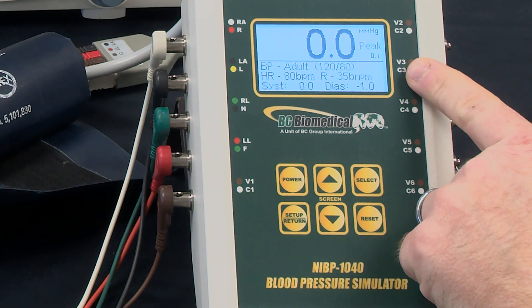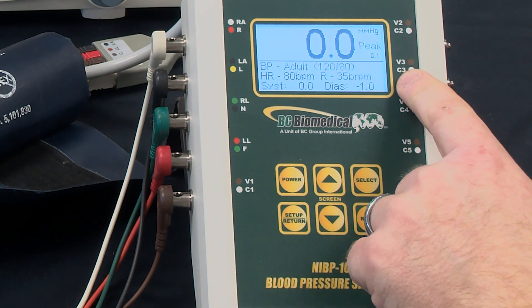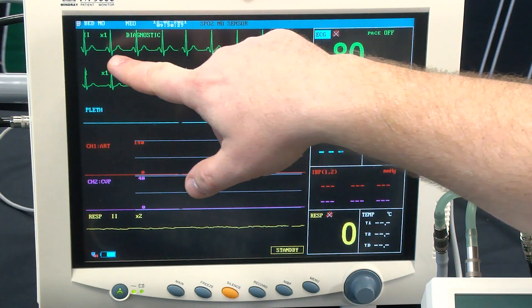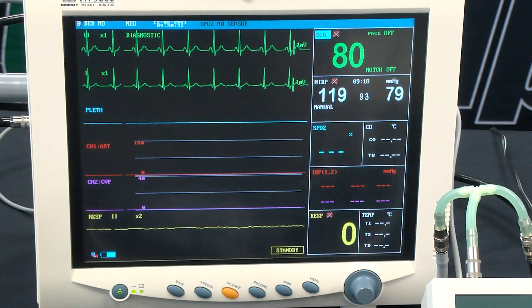The NIVP will default to 120 over 80 BP simulation with a heart rate of 80 beats per minute and a normal sinus rhythm. We can see lead two is showing a normal sinus rhythm and our rate is 80 beats per minute.